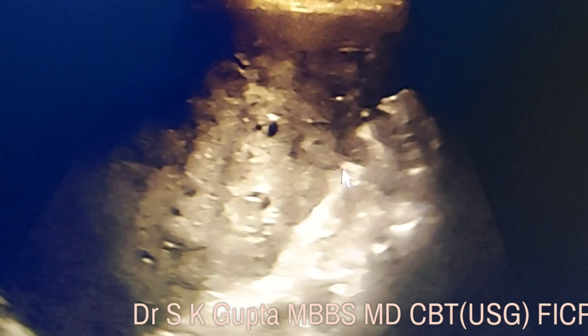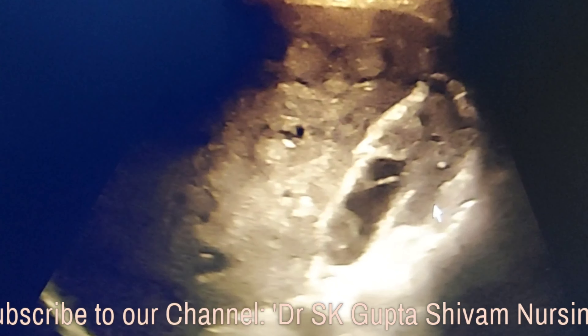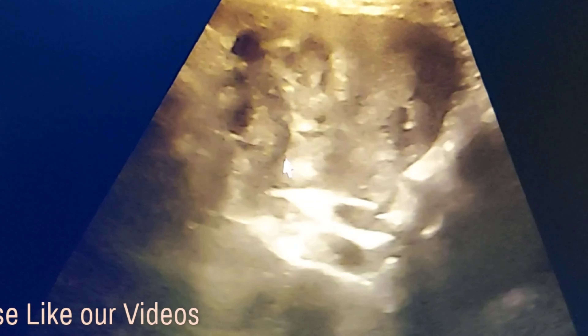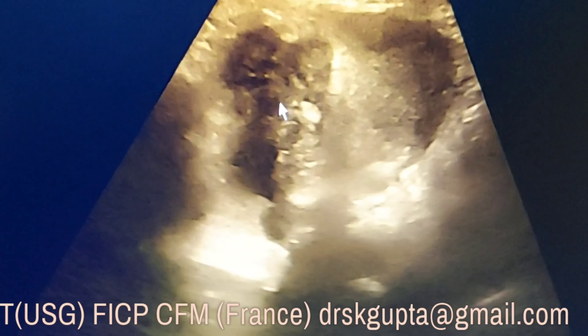This is the gallbladder, which seems to have a mass over here, and there is an impression that there might be a stone in the gallbladder. So probably the gallbladder mass has given rise to the secondaries into the liver and this could be the culprit. In another section you find that the gallbladder wall is thickened and the gallbladder has a mass-like effect in the fundus, suggesting these secondaries are from the gallbladder in this patient.